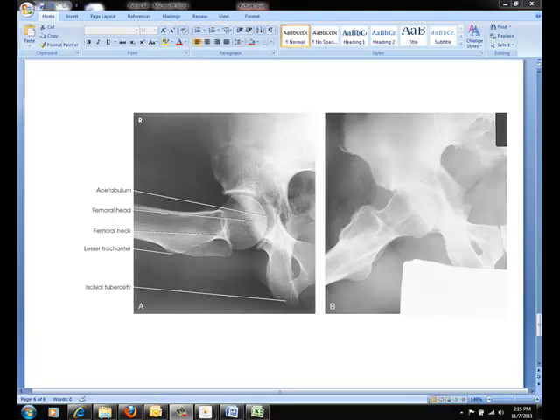On a side note, one thing I'd like to mention is that the Cleaves method, which is often used in the clinical setting for the lateral projection, is also known as the unilateral frog leg.